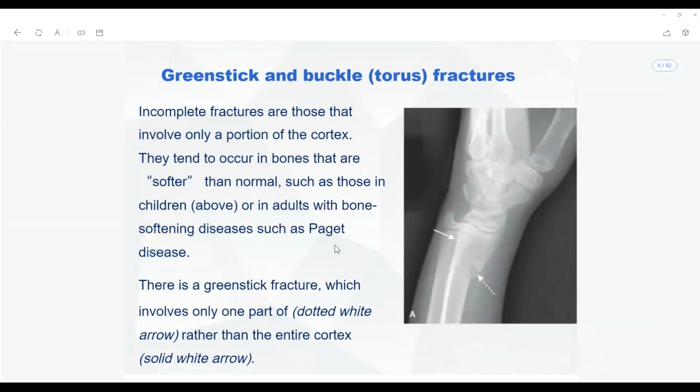Let us say a patient came with right hand, right wrist pain. You are not going to look at only his right hand, but you are also going to look at his left hand as well, because comparison of the symmetry is always important.